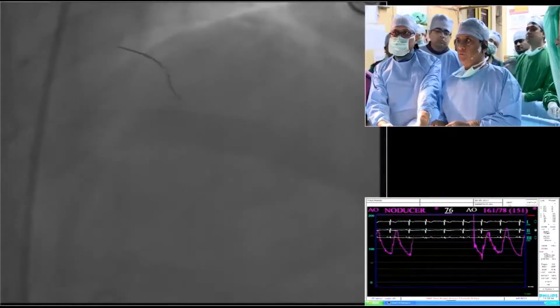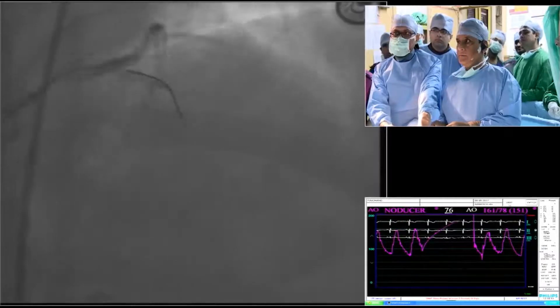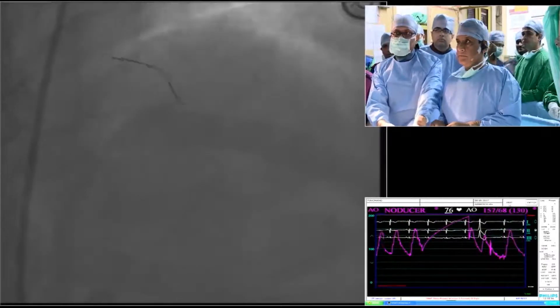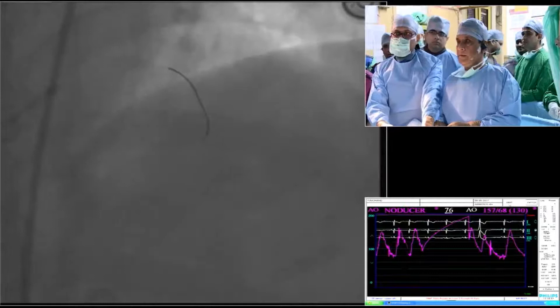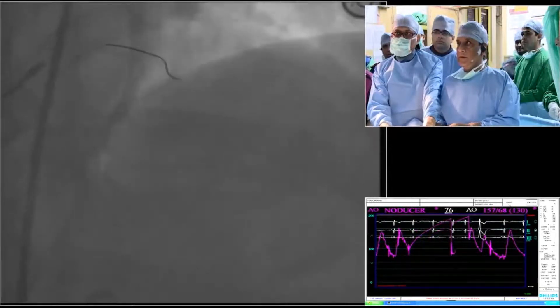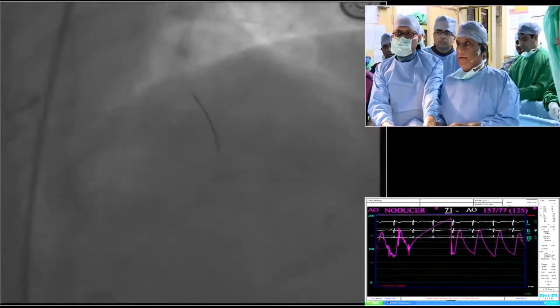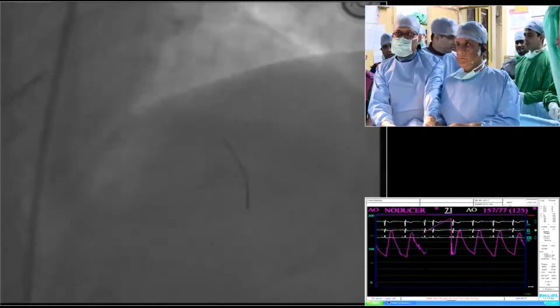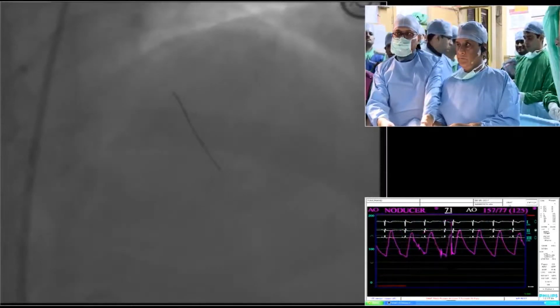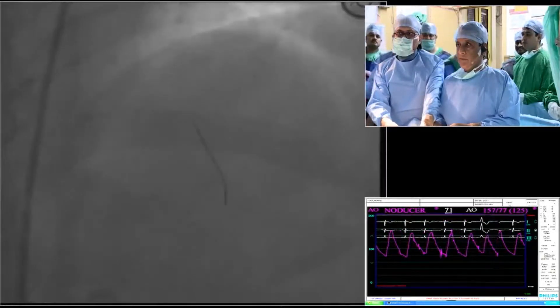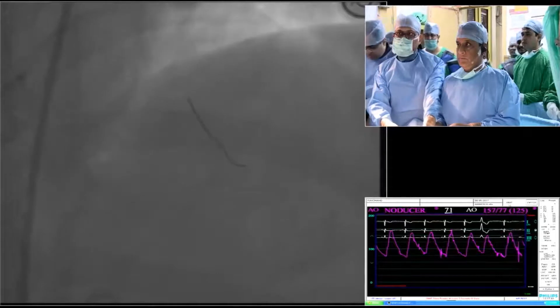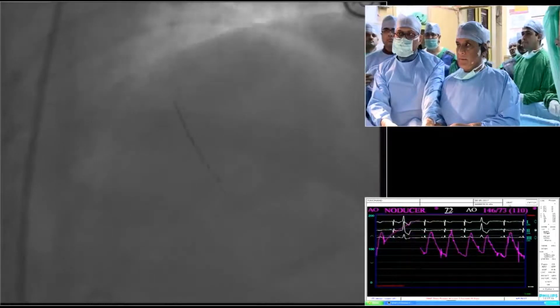This is a run-through wire. I think it's in the septal now. I may need a balloon support. This is the LAD. In this case, you do not need a contralateral injection.